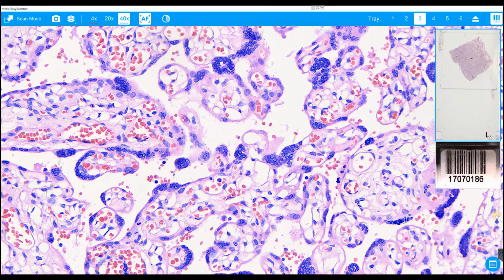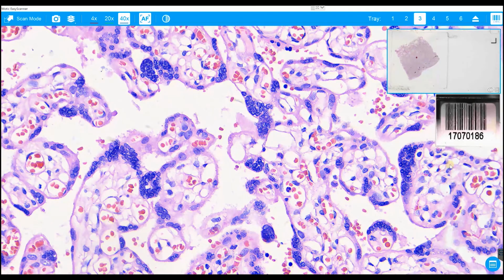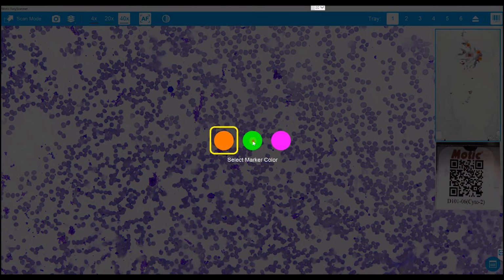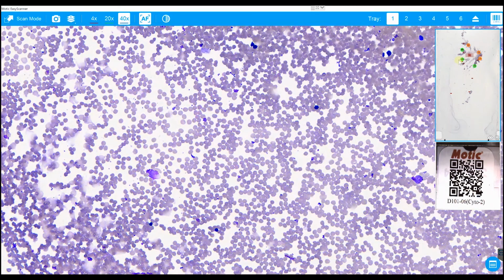Pressing Ctrl and the letter O will change the orientation of the overview. This will give the user the traditional microscope feel and view. You also have the option to mark areas within the overview, which includes changing the color of the circle by pressing the less or greater than keys. Pressing the letter M in the key map can place a marker as well.